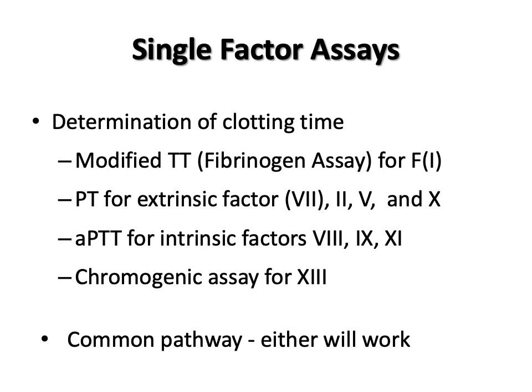Other factor deficiencies are tested for in a similar manner, except the PT or APTT is performed instead of the thrombin time, depending on whether the factor being tested for is an extrinsic or an intrinsic factor. If the factor is part of the common pathway, either the PT or APTT is performed.